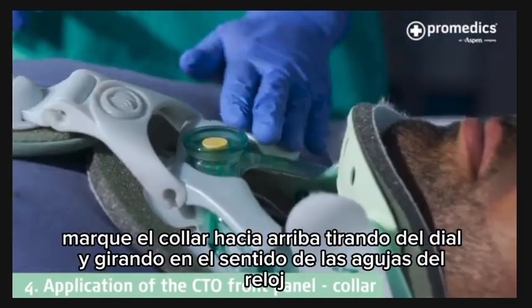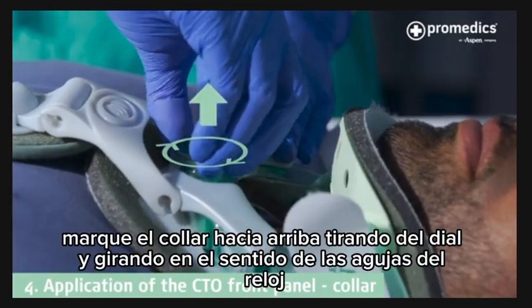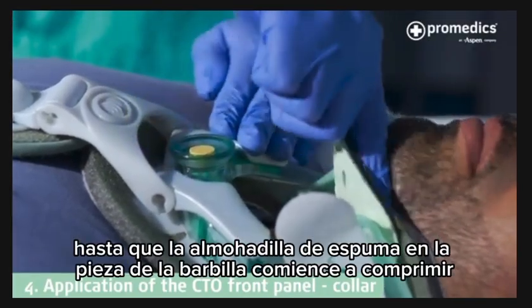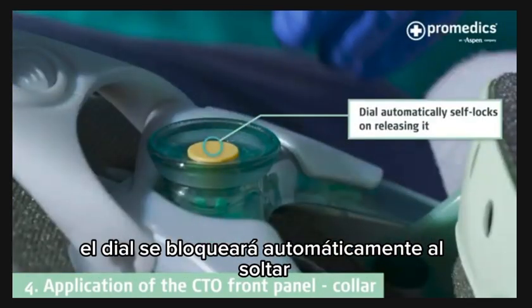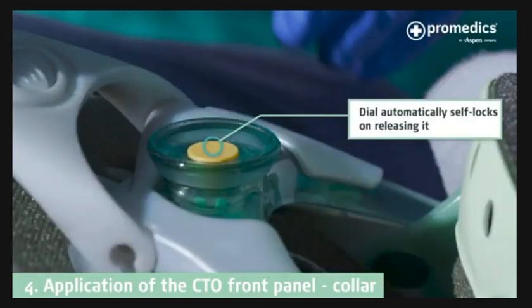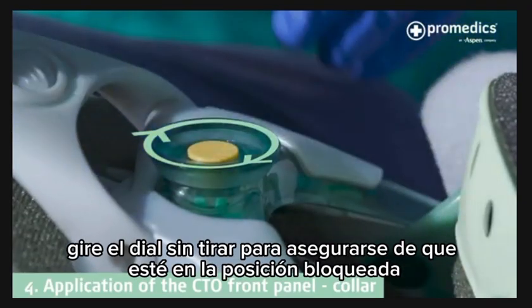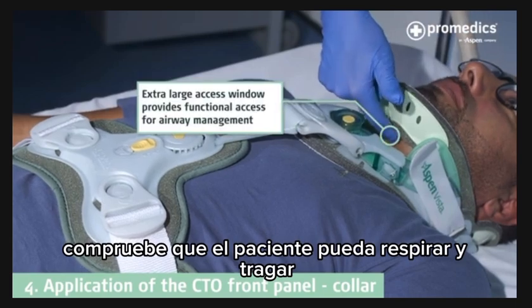Dial the collar up by pulling out the dial and turning clockwise until the foam pad on the chin piece starts to compress. The dial will automatically self-lock upon releasing. To ensure the dial is locked, twist the dial without pulling to ensure it is in the locked position. Check the patient can breathe and swallow.